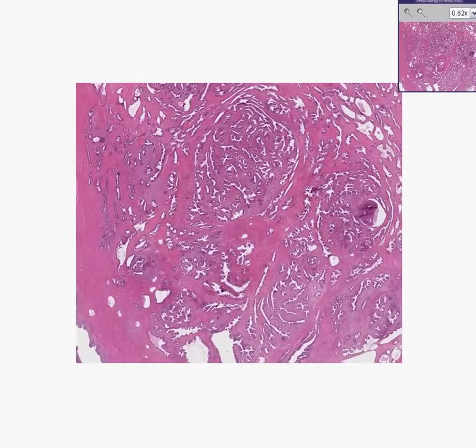I promise you this is our last prostate, because it is. And instantly, by now, you can see this is prostate. But notice that the glands are arranged, and you can see this grossly as well as little nodules. There's a nodule. There's a nodule. This probably would look like a nodule grossly. And the nodules are separated by relatively thicker bands of connective tissue.